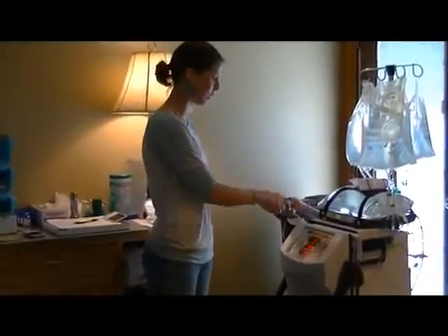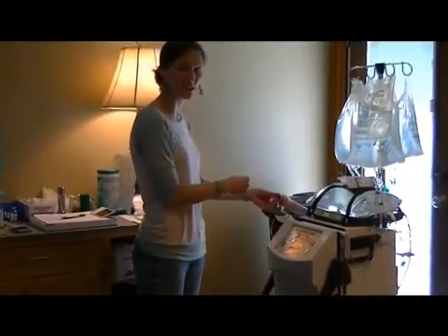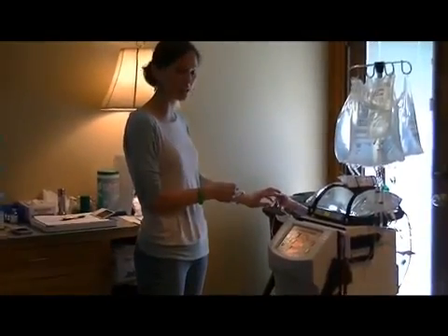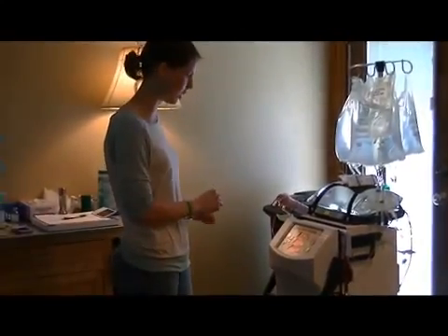If there's air, you put a syringe on with a needle, pull the air out, and then flush with saline again so that it doesn't clot. If this starts clotting, then you've got problems and you'll get a bunch of alarms on the machine.